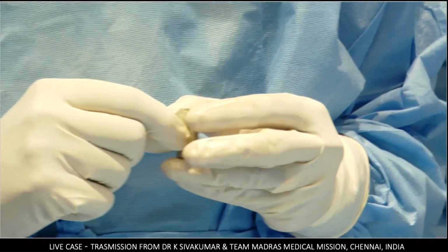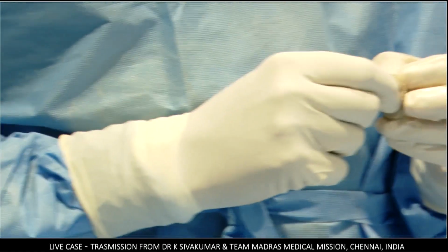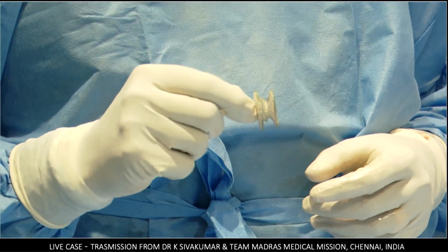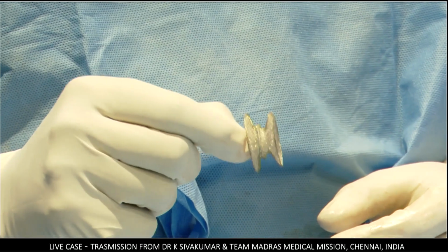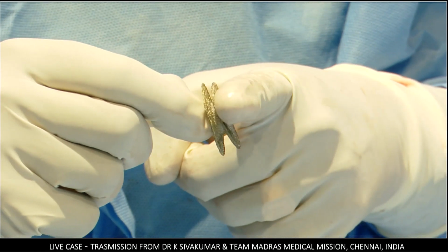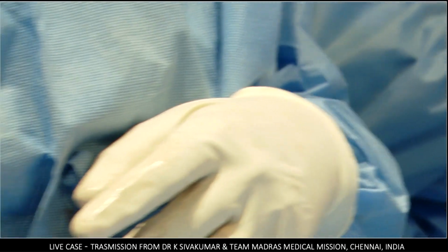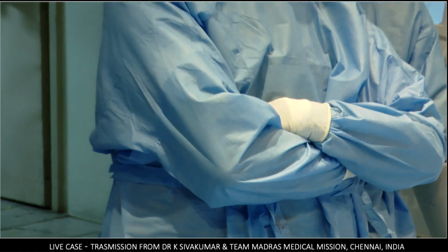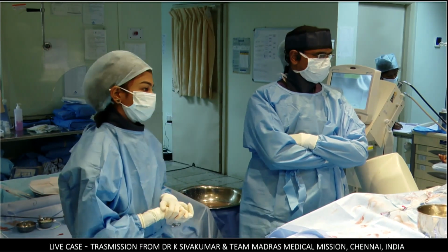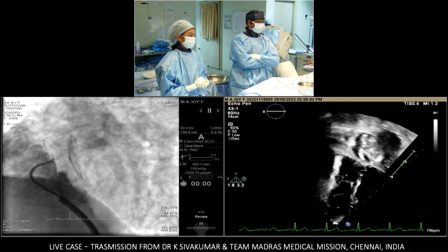So that left atrial disc is protruding quite a lot into the left atrium, isn't it? Can I just make a comment? We're discussing what this device is all about. As I understand it, it's to do with this offset septum or malaligned septum. The problem with our current devices is that you are trying to splay a device from the left to the right side and negotiate a large ridge, typically the septum secundum, and then it's splayed further because the attachment, usually superior anterior, of the primum is then placed more into the left atrium. So the disc on the left side is then splaying right across with the waist to the right side.